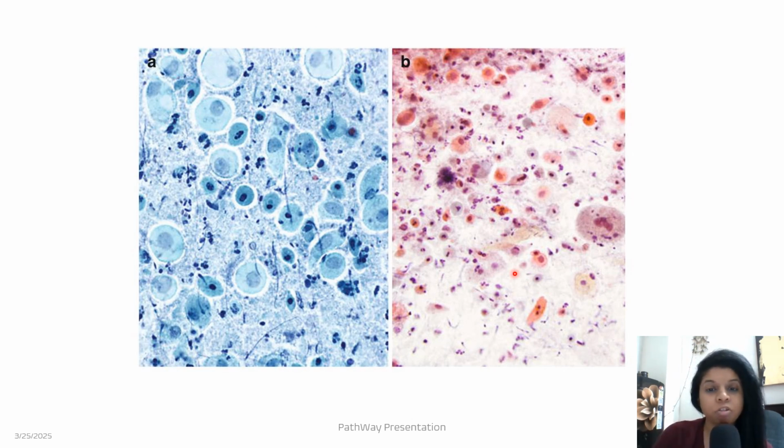So this is an atrophic vaginitis smear, and my examiner in my exam had said that if it is an atrophic smear and you're getting so much inflammation, it is important that you mention it as atrophic vaginitis, because then the patient will be treated for it with hormone replacement therapy, etc., because it has so many symptoms like drying, itching, and all those things.